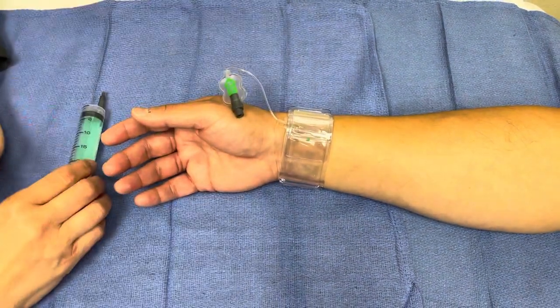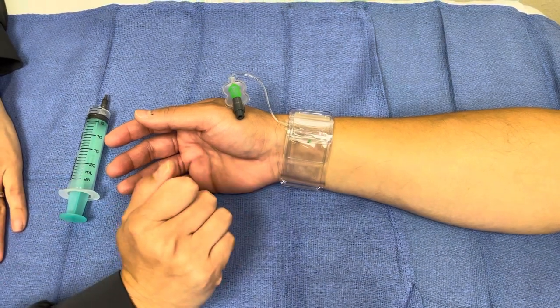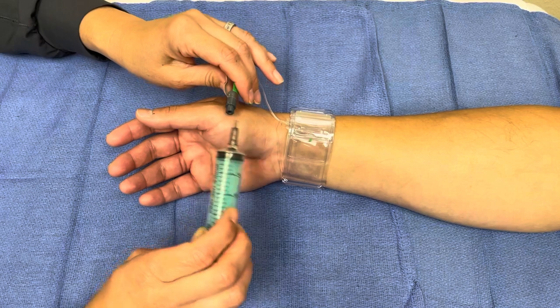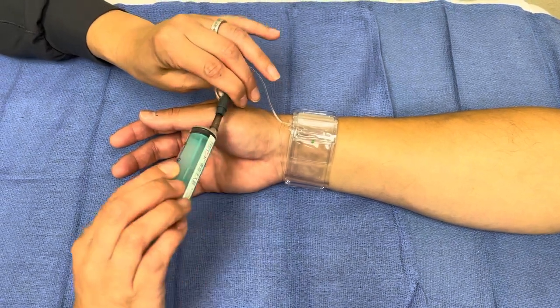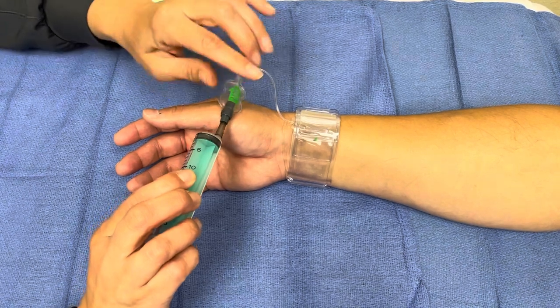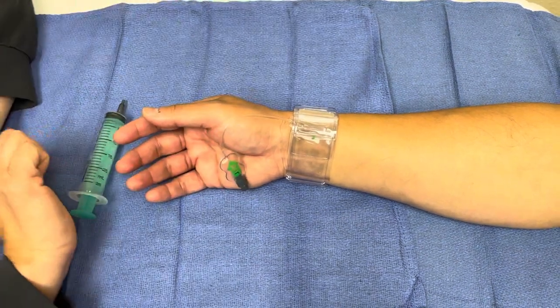Then we're going to wait 15 minutes and assess the site. If it was to start bleeding back at you as soon as you take the two cc's of air out, we're going to reapply the two cc's that we just took out and we're going to let it go for another 15 to 20 minutes.